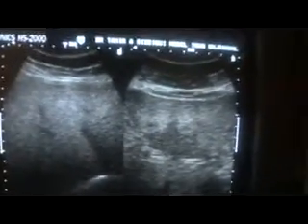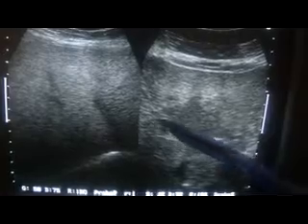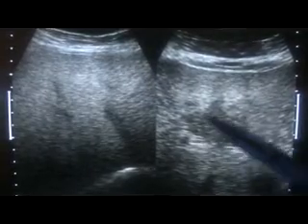So that's the reason. By the time the sound waves reach the diaphragm, they are absorbed to an extent. This area becomes hypoechoic, and we cannot say that this is a focal fat spared area. The reason is, now compare these two, and you will come to know the difference. Compare both. So it's very distinct, a benign, incidental finding with no complaints. Patient usually will present with no complaints whatsoever.